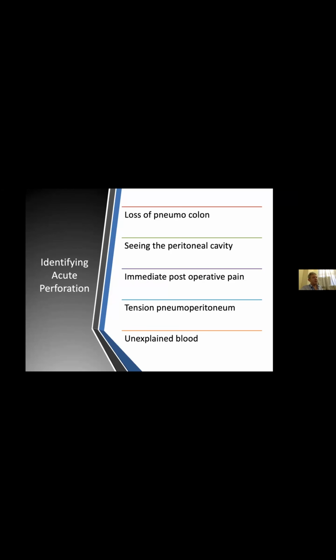It's unusual, but have a look at the abdomen. If it's massively blown up and you've been blowing CO2 and air into it for the last half an hour, that can certainly cause blood pressure to drop. The other slightly more subtle sign as well: you're coming back and at the recto-sigmoid junction, you suddenly see a whole lot of blood.